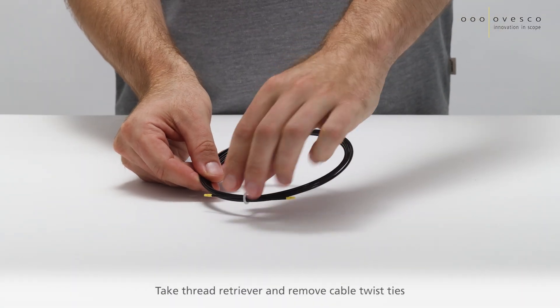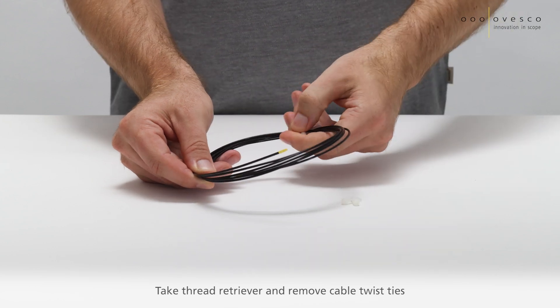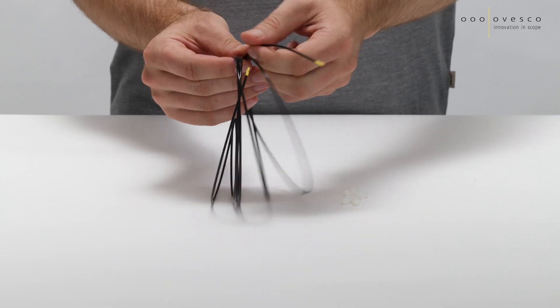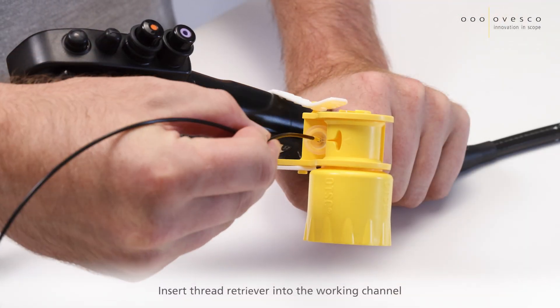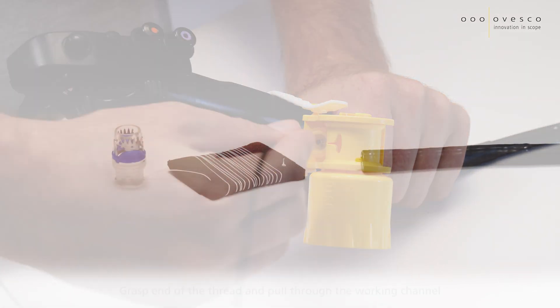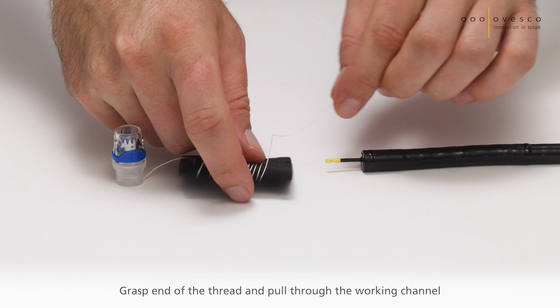Take the thread retriever and remove both cable twist ties. Insert the thread retriever into the working channel, then grasp the end of the thread and pull it through the working channel.